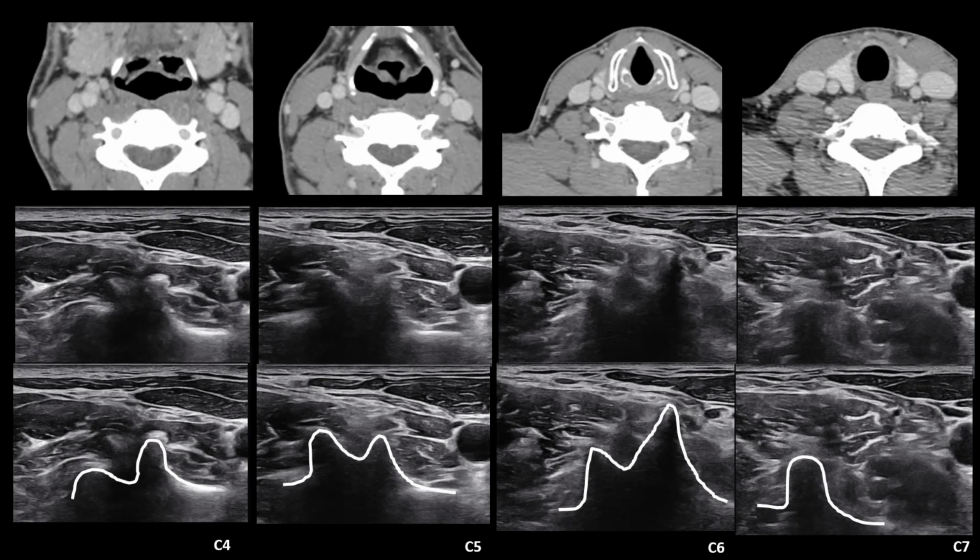If you want to find the transverse processes during neck US, the easiest method is to find the anterior tubercle of C6 and move the probe slowly up and down. Because the anterior tubercle of C7 is rudimentary in many cases, it is hardly seen on US. At this level, the brachial plexus is seen anterior to the posterior tubercle of C7.